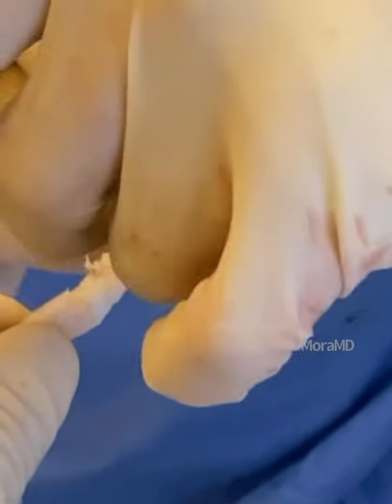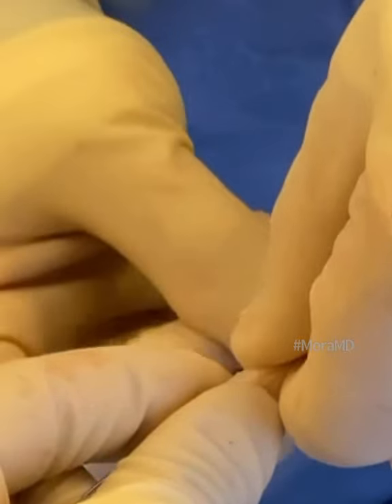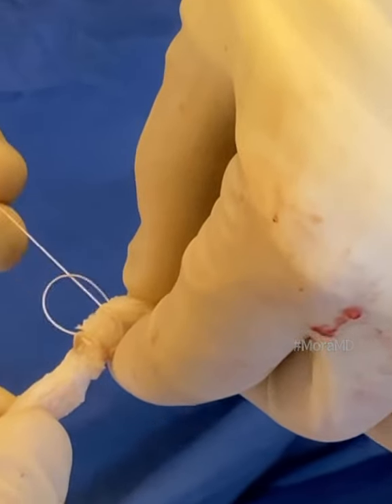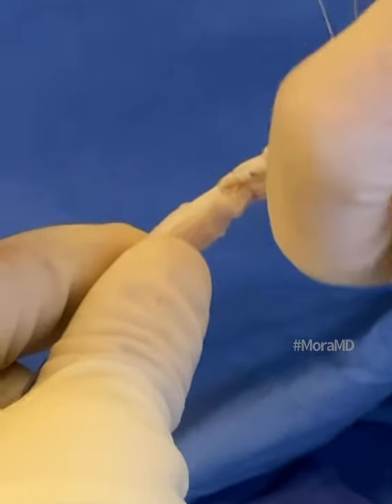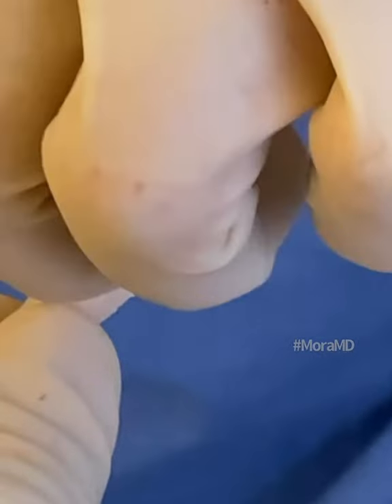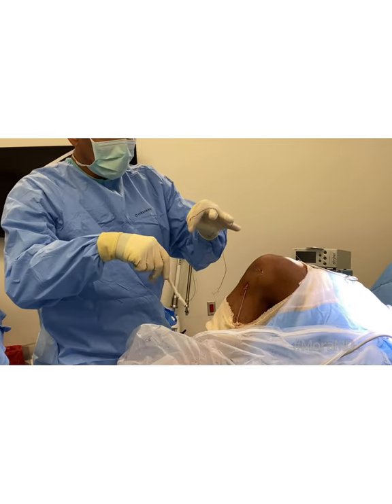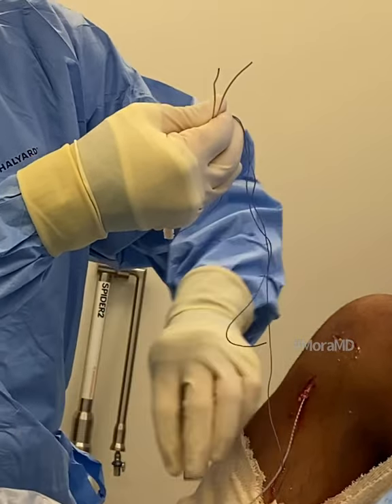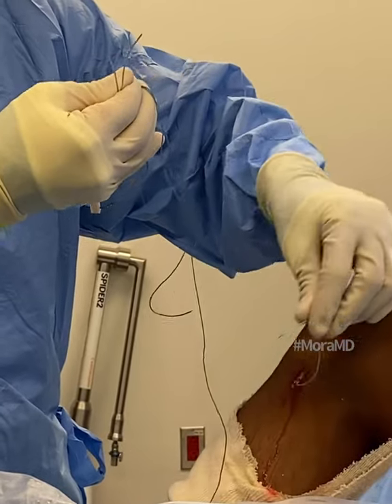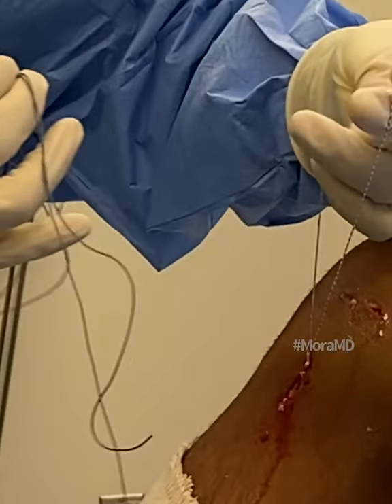I set my loops about 5mm away from each other and lock it — that seems to snug it up a little nicer. It makes it into a tube; some people call it tubularizing the graft. Half hitches all the way down — the graft is right here, with the bone end ready. My loop is already in the knee; this is a loop that is going to pull or shuttle the graft in.